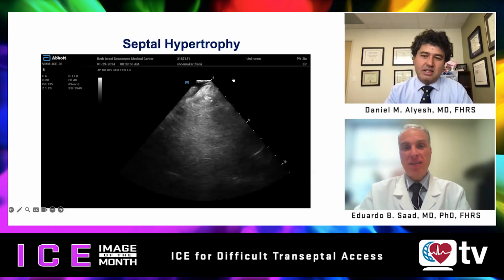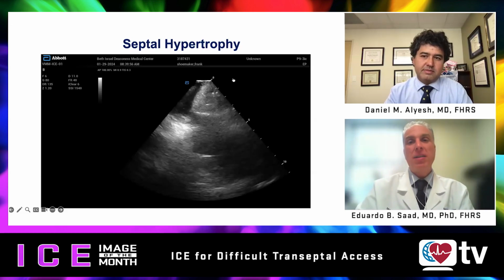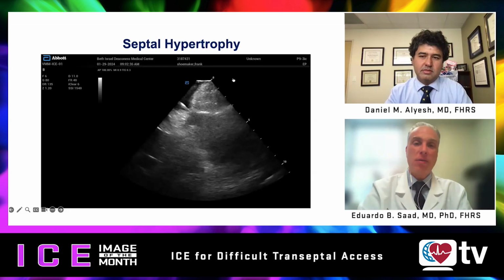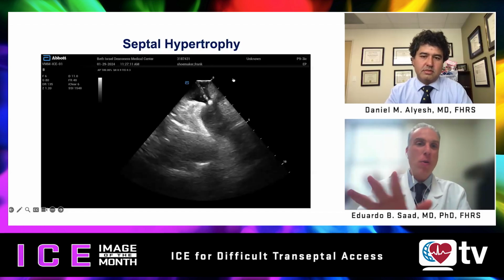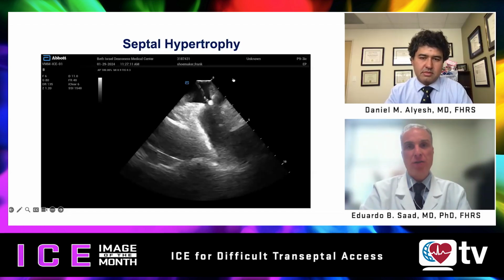Absolutely. I think it's especially, as I said, with PFA, it became more and more important, especially for fluoroless PFA. I think that's key to having great visualization of the contact of the catheter and the position of the wire. So there's no question that left-sided ICE is a game changer.